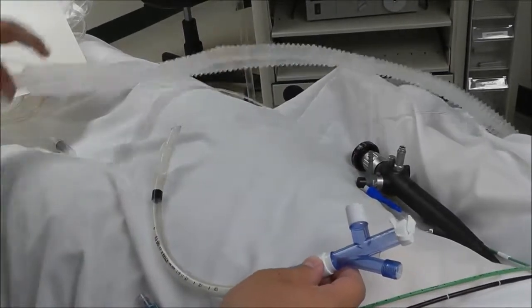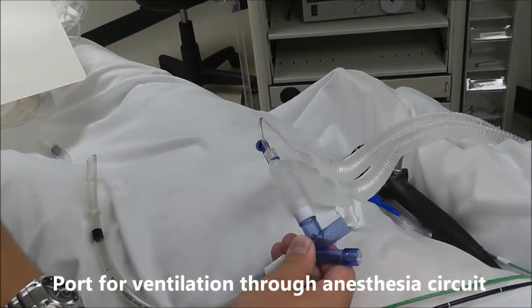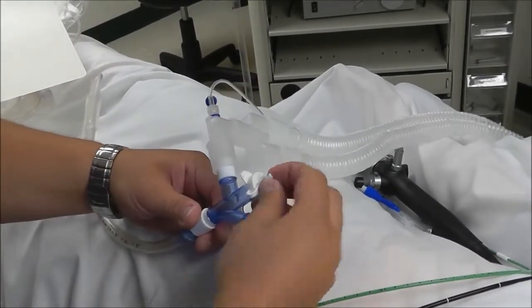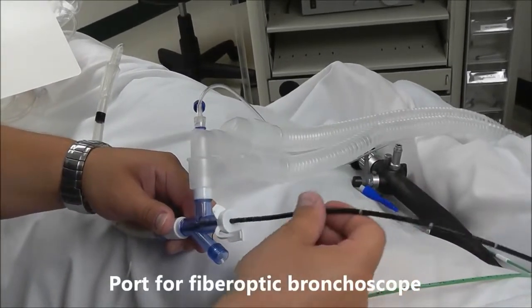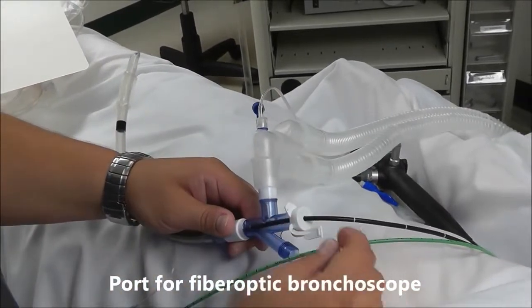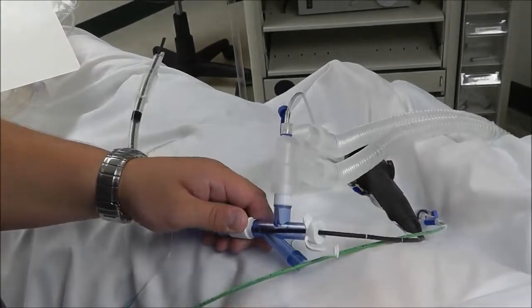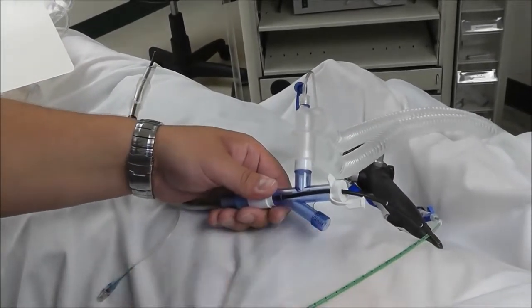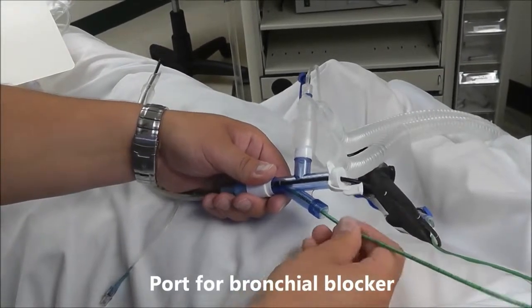This side port allows for connection of your circuit to allow for ventilation throughout the blocker placement. This top one with the rubber gasket allows for placement of your fiber optic scope down the endotracheal tube. The gasket seals, that way you can still provide positive pressure ventilation throughout the blocker placement. And this other port on the side allows for placement of your bronchial blocker.